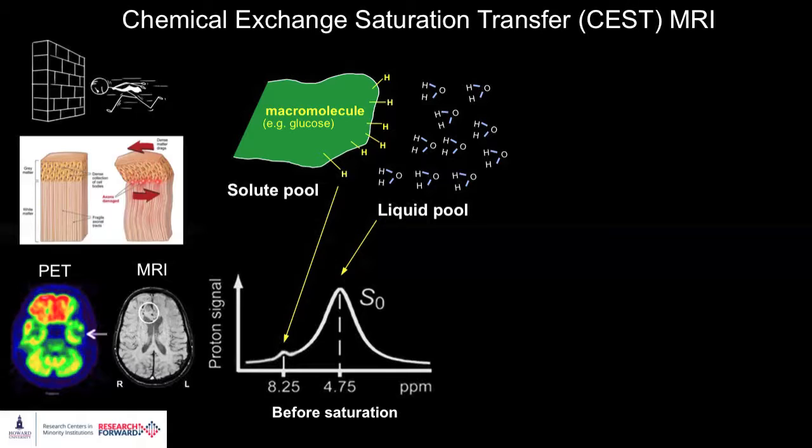However, PET imaging uses radioactive isotopes and it is usually blurry most of the time, not very sensitive in detecting mild TBI. On the other hand, MR imaging provides high resolution and the sensitivity to detect brain damage such as microhemorrhages. In this project, we are applying a new MRI method called CEST MRI to generate high resolution glucose images of the brain.